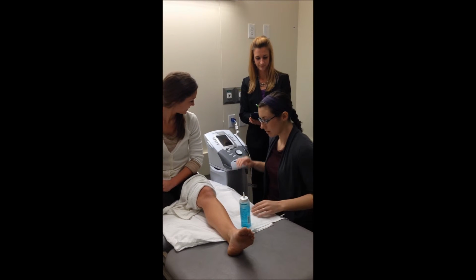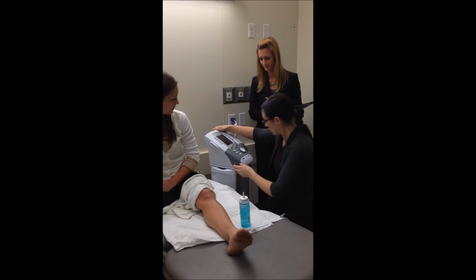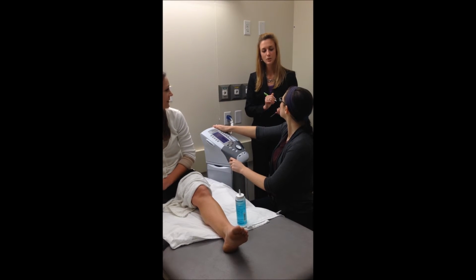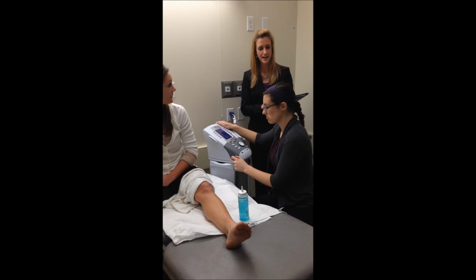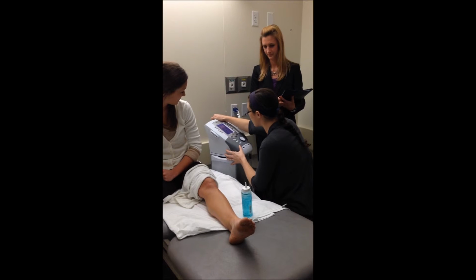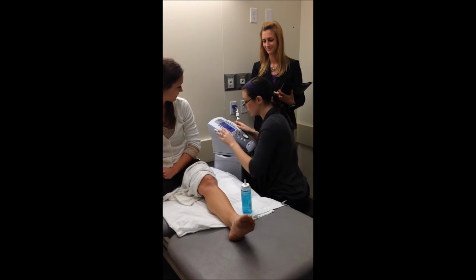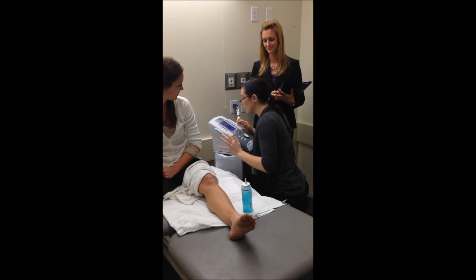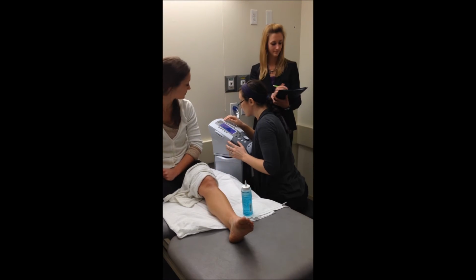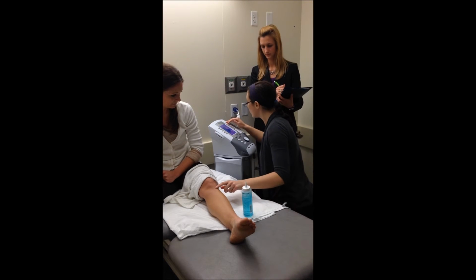You can begin. All right, well, I'm going to turn this thing on. These dang newfangled machines. Where's the old one? The old one's dysfunctional. The ultrasound head had a hot spot, so we're replacing that one. Upgrading. Well, I don't like these new ones. Okay. I think we're doing ultrasound here. Edit, edit. And we're going to be doing this here, patellar tendon.